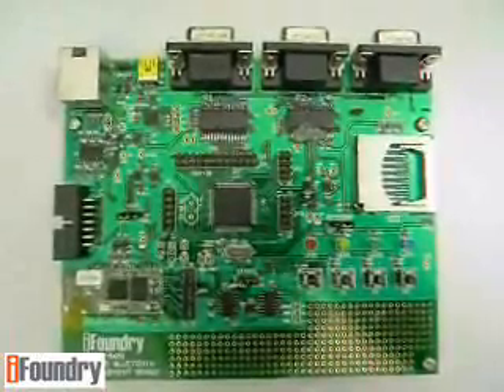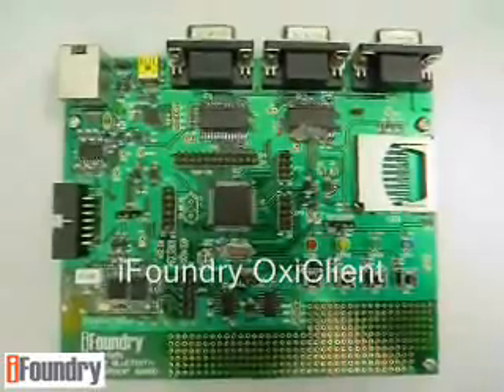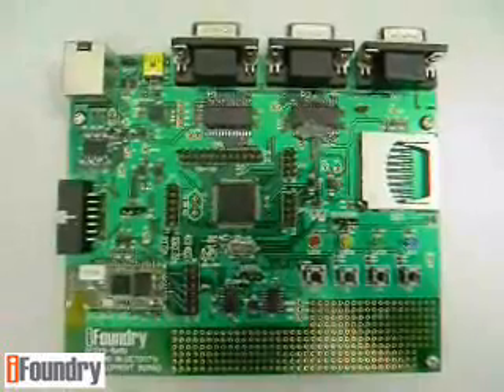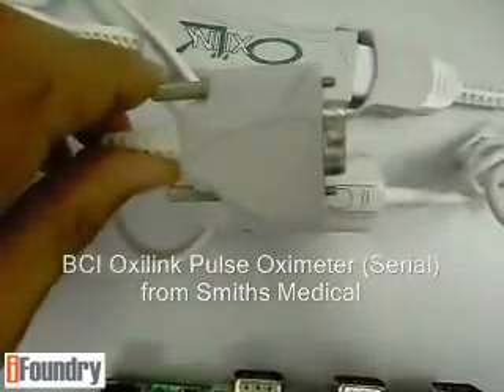You also need to install the OxyClient pulse oximeter application, which is part of the 5043 OxySPP package described earlier. You will also need to get hold of the BCI OxyLink pulse oximeter from Smith's Medical — specifically the one with the serial connector.